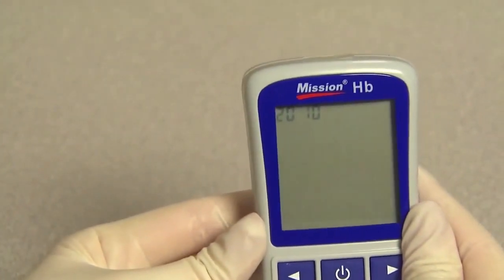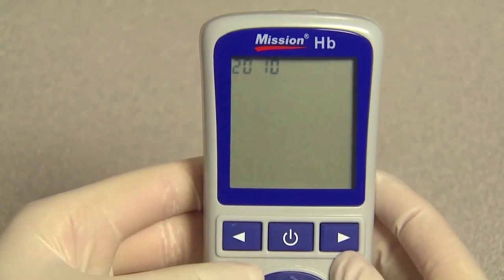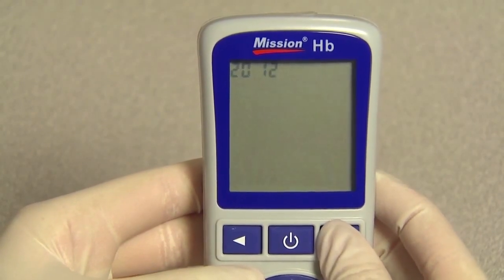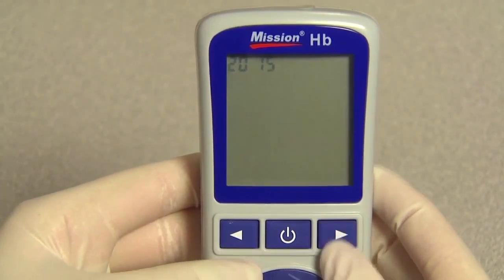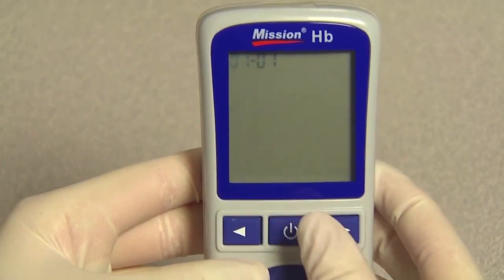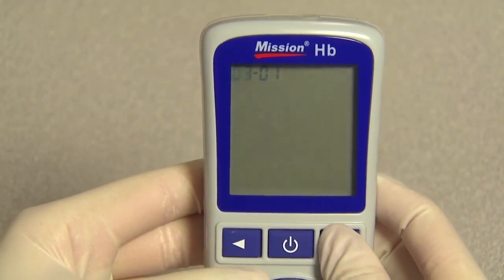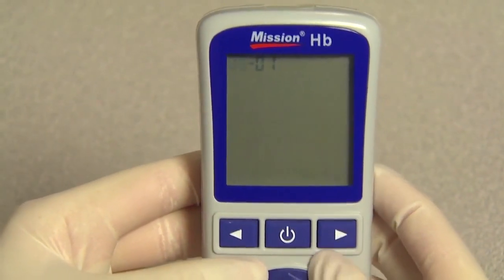The meter will automatically turn on after the batteries are inserted and will enter the time setting state. Press the right or left button to adjust the meter time setting of the year. Then press the power button to save. Press right or left to choose the correct month. Then press the power button to save.